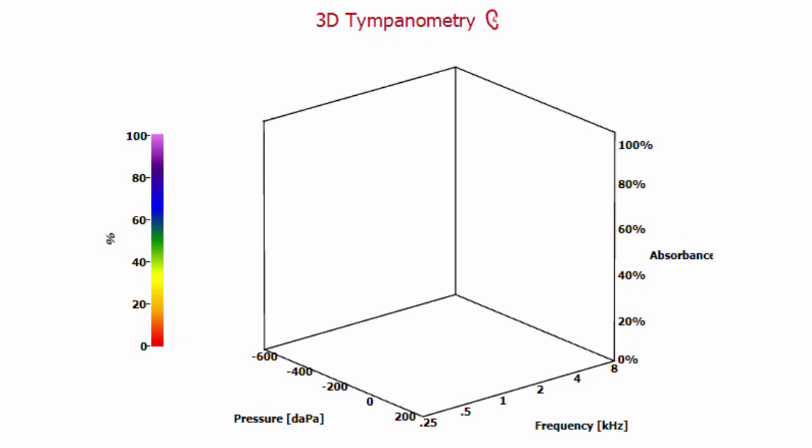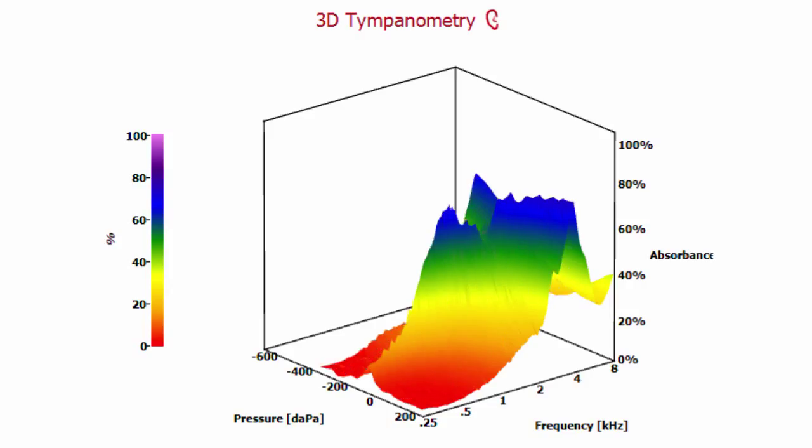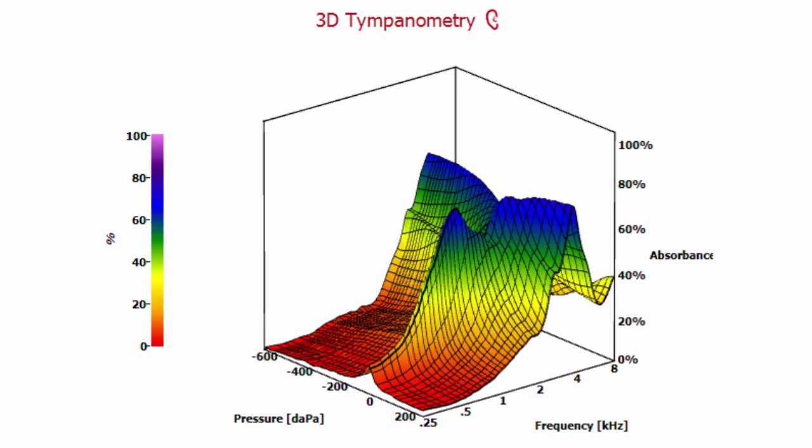The pump now builds up pressure. Data begins to appear on screen as soon as the positive starting pressure is reached. The pump moves the pressure back to ambient pressure and continues to the negative stop pressure. By now, you can see a mountain of data on the screen, consisting of tympanograms for many frequencies.